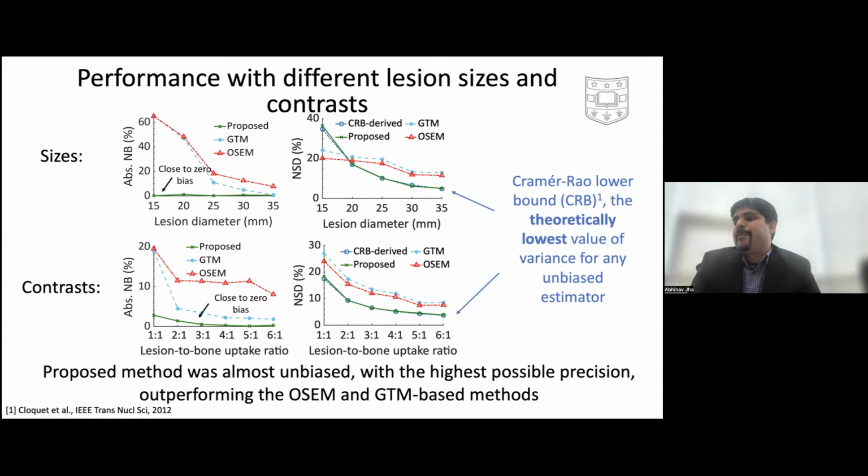I find that, especially for small lesions, even with many iterations it's still not convergent. Yes, so we keep pushing. We do more iterations and eventually we find convergence. I think it's very important that we ensure there is convergence before we make any comparisons. We try to be as rigorous in our experiments as possible. For our reconstruction-based methods as well, the results you're seeing were optimized, because we wanted to ensure that our reconstruction-based methodology is also the best of what it can be. And of course, our methodology is the best of what it can be. So we are comparing apples to apples here.